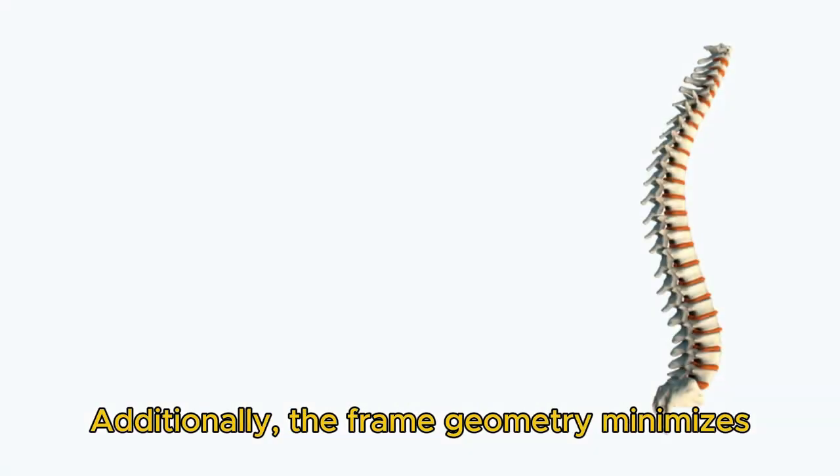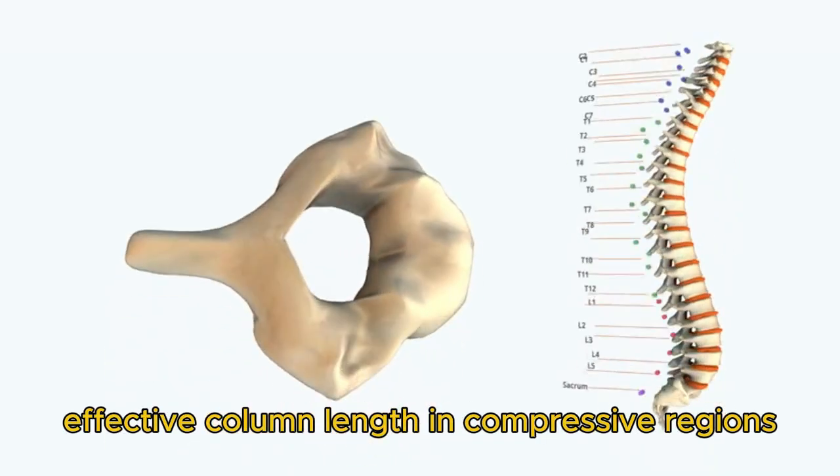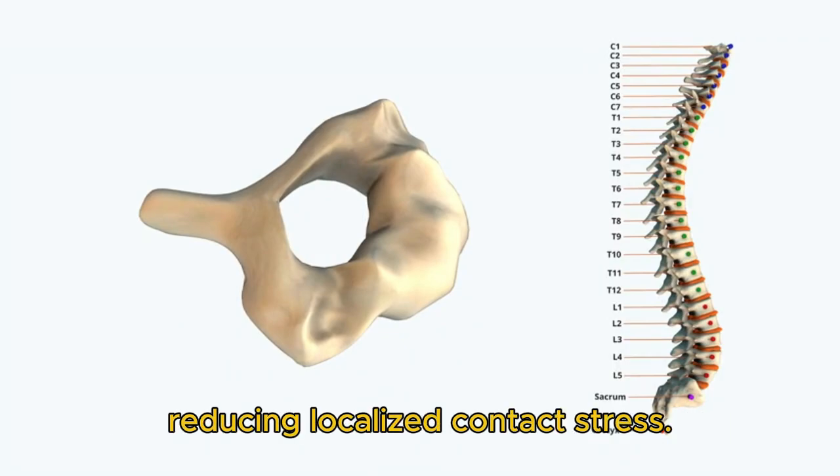Additionally, the frame geometry minimizes effective column length in compressive regions to prevent buckling, and padding interfaces distribute pressure evenly across soft tissue, reducing localized contact stress.